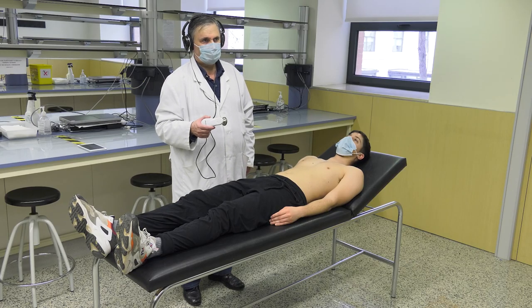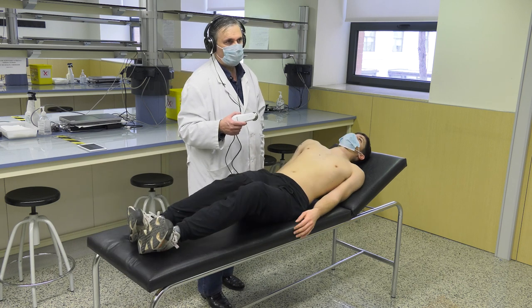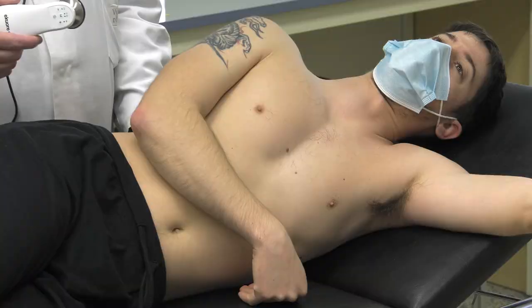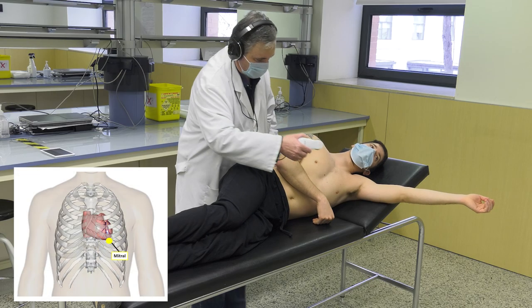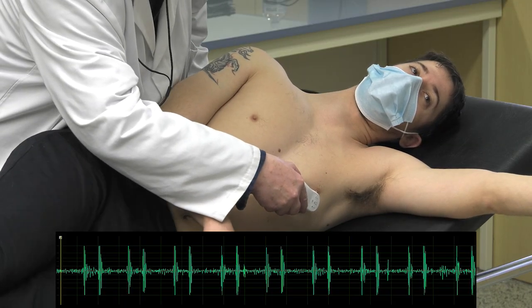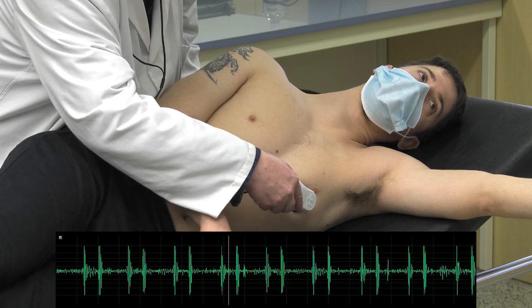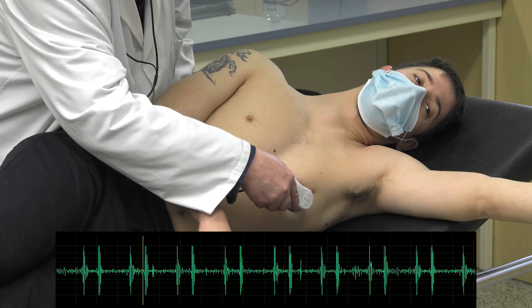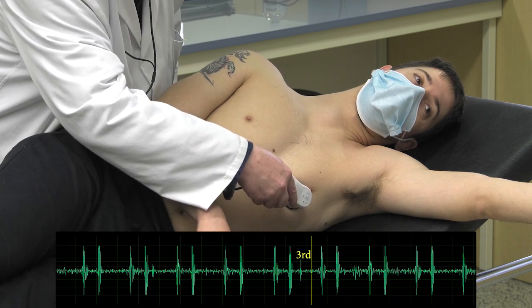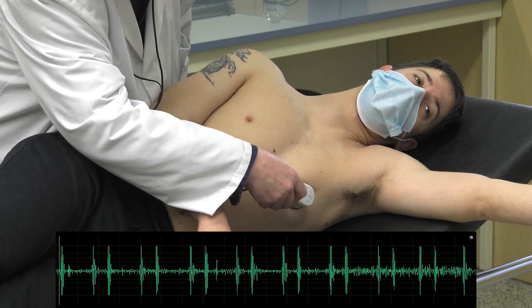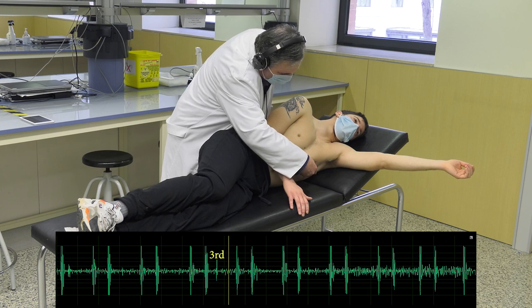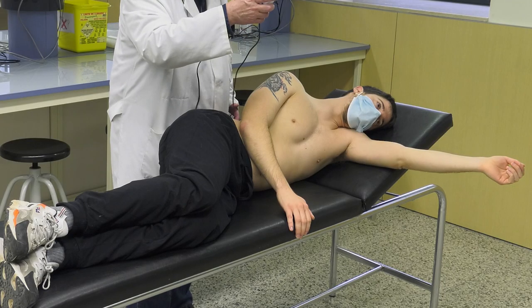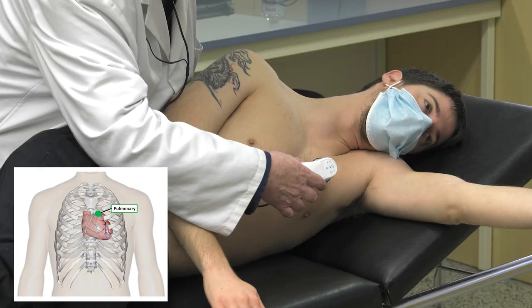Please lie in the left lateral decubitus with the left arm stretched out. In this position, we will auscultate the mitral focus, which favors the auscultation of the third tone and fourth tone if present. The third tone is physiological, while the fourth tone is pathological. In the same position, we are going to auscultate the third tone in the pulmonary focus.